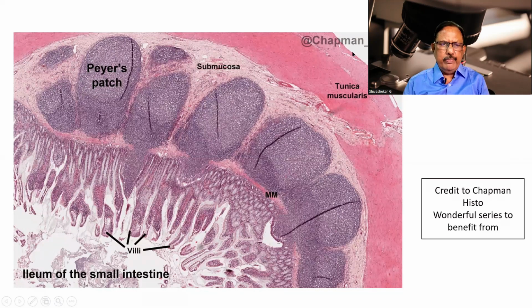Here, I am able to see the intestine, and these are the villi, the mucosa. The small intestine or the ileum intact has these well-circumscribed structures called the lymphoid follicles. Lymphoid follicle means I am finding some pale areas, which are the immature cells in the center, and some darker rim, which are the mature cells in the periphery. They are called the Peyer's patches. Overall, you find that they have got an oval kind of an outline, which is important in some pathology.